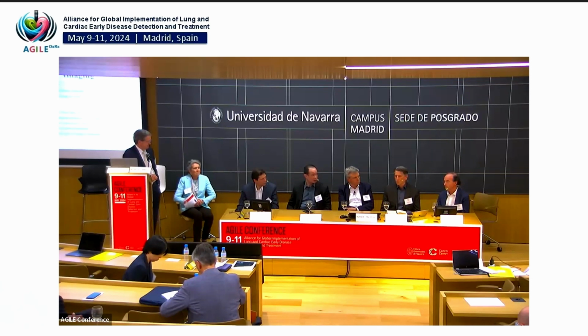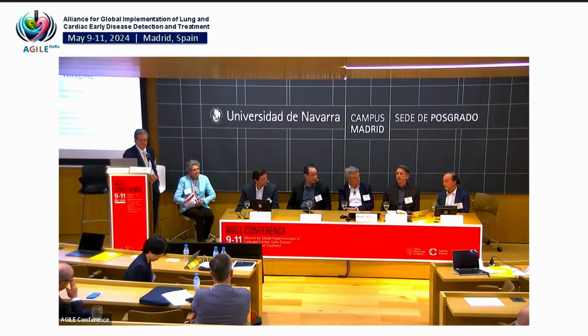In our profile, we were confined to a smooth kernel, and the idea behind it was not to do multiple recons. But if you do go that direction, you can further optimize your approach to amplify the spatial resolution for the purposes of the nodule volume measurement, and then use a smoother kernel for the quantification of the parenchymal density. And I like that approach a lot. I think that's probably a great way to go.